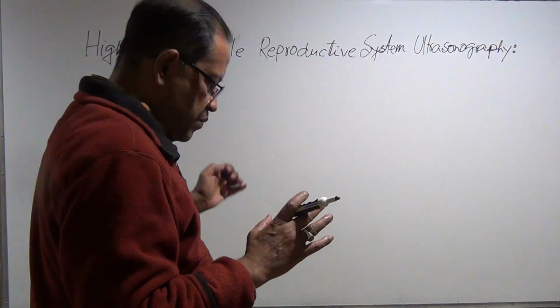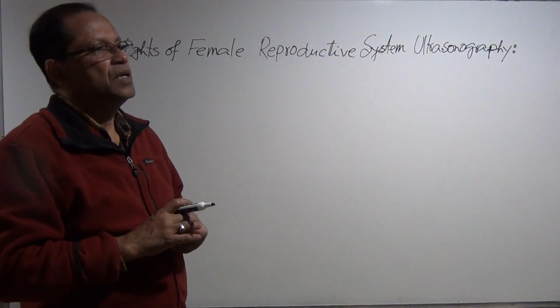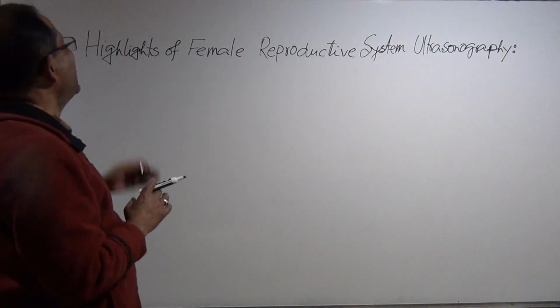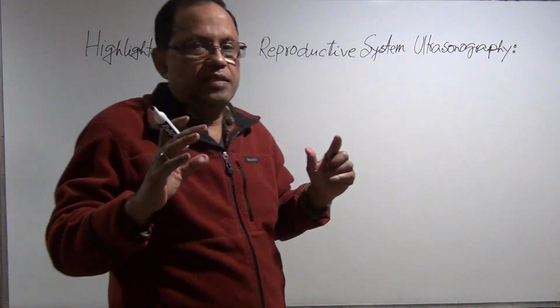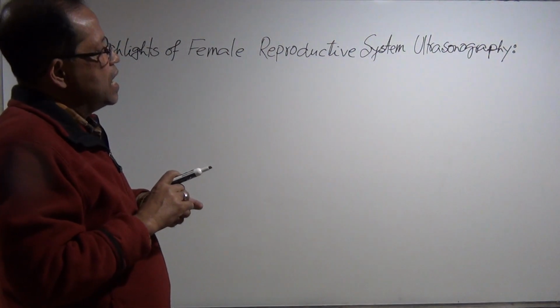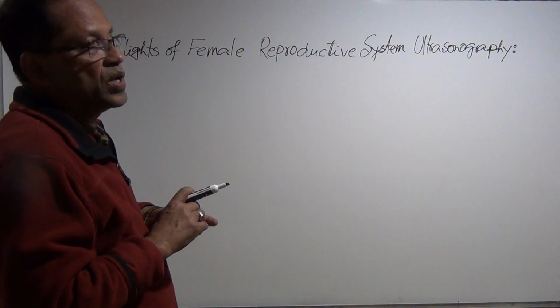I am not going into details about the anatomy, physiology, and others, but I will point out the important points that are very important clinically and also important for the board exam.